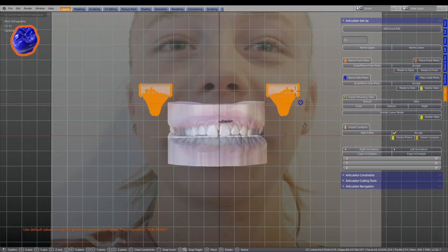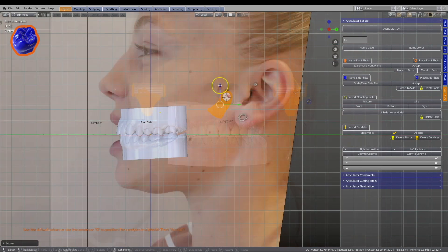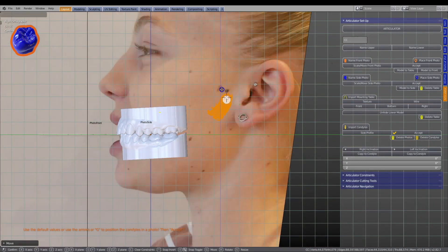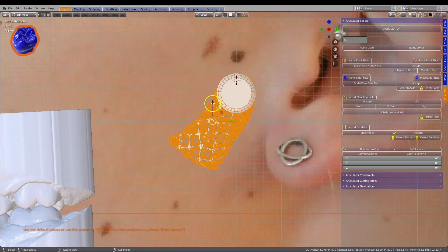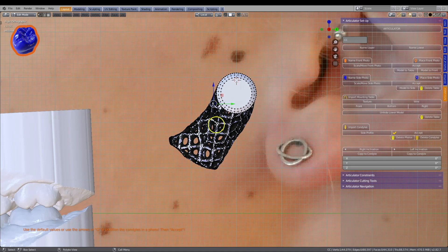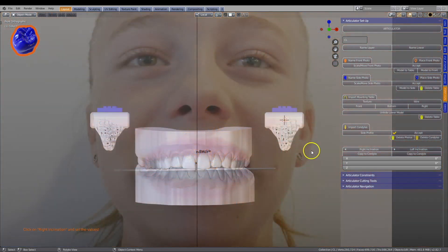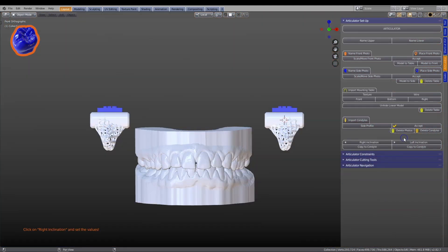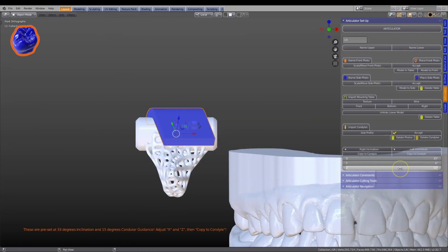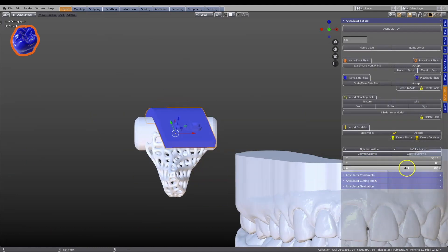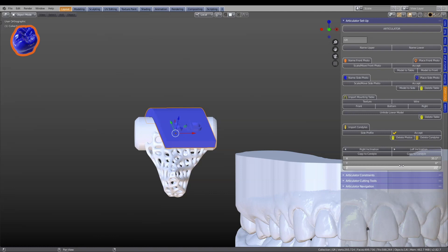Then move the biologically designed condyles into position. Condyles are fully adjustable, including Bennett's side shift.